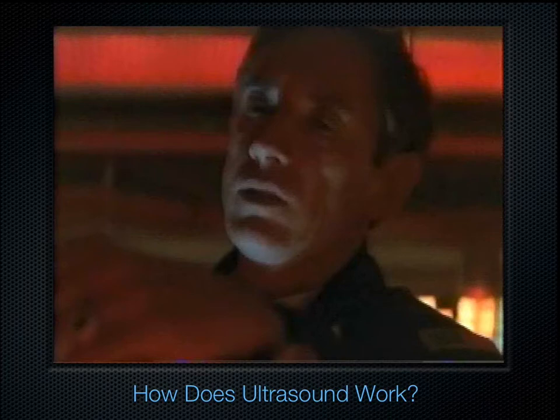And it turns out that the denser the structure, the brighter the dot, and the less dense the structure, the darker the dot. So bone is really dense, and so that's going to be really bright, really white. And fluid-filled structures like the bladder or the gallbladder or free-flowing blood are not dense, and so that's going to be black on ultrasound.